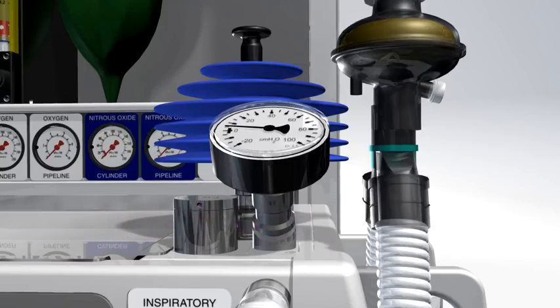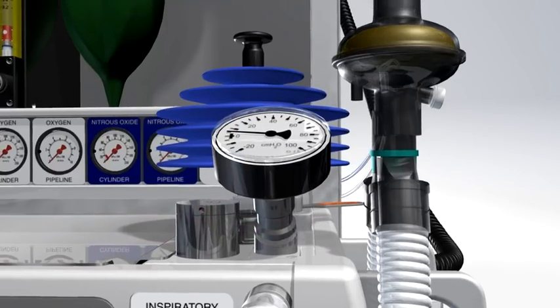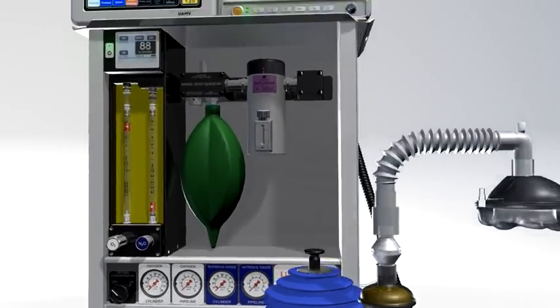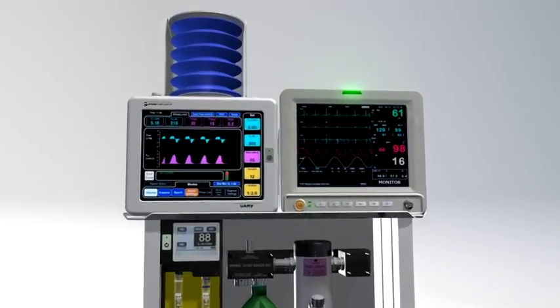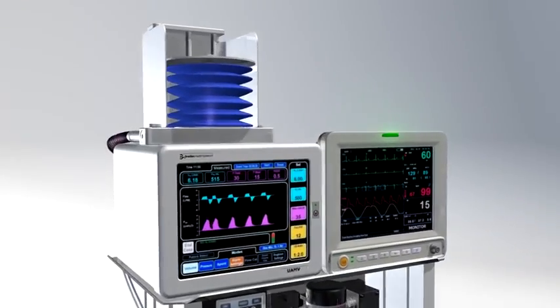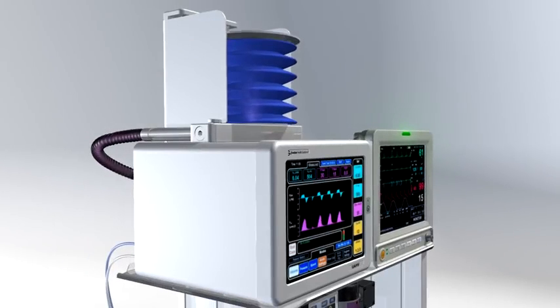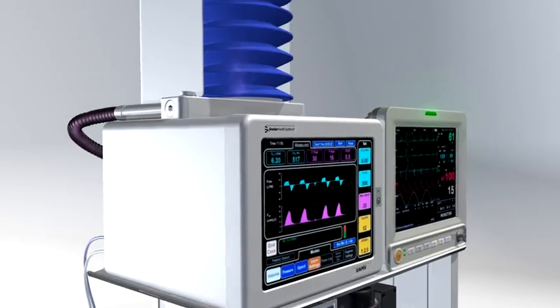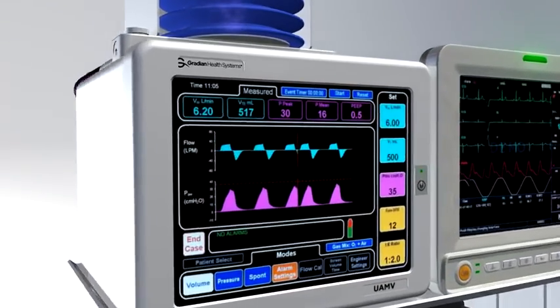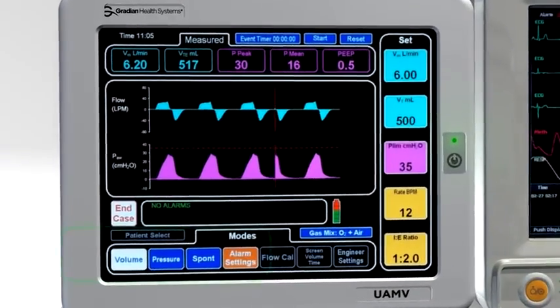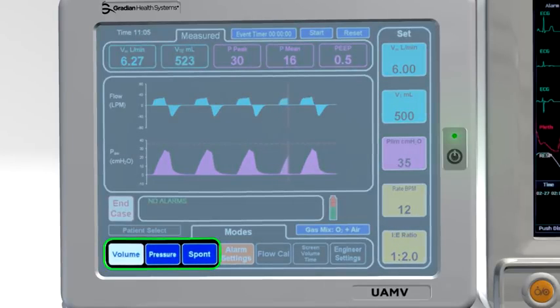The optional ventilator provides automatic IPPV. It is electrically driven and does not require compressed gas. Internal batteries provide up to 6 hours of backup operation. The UAM ventilator operates in volume control and pressure control modes. During spontaneous breathing and manual IPPV, it will display pressure and flow readings.